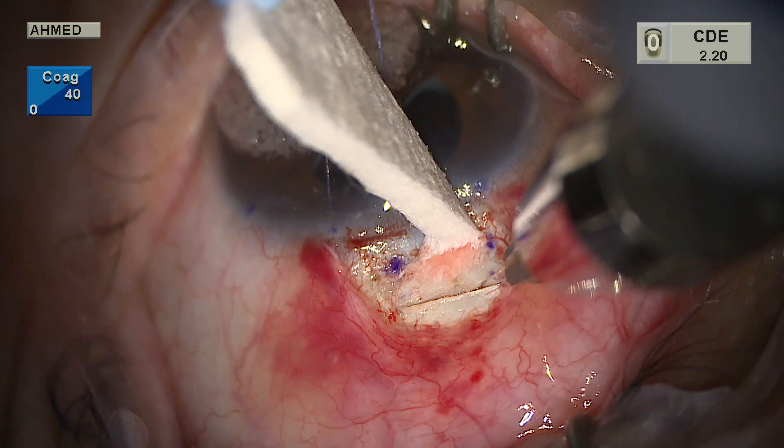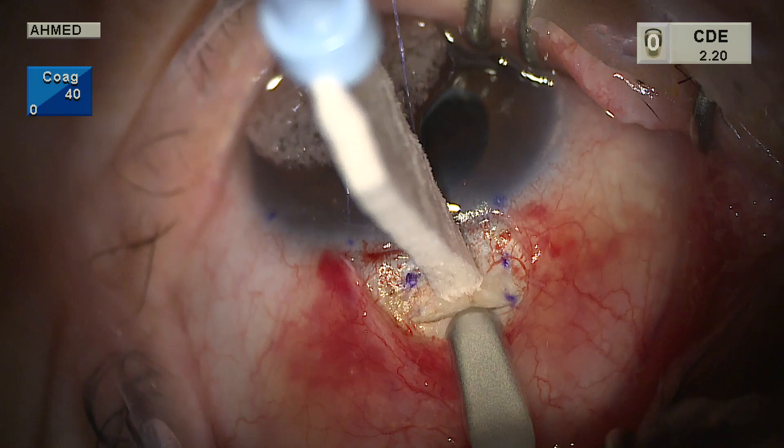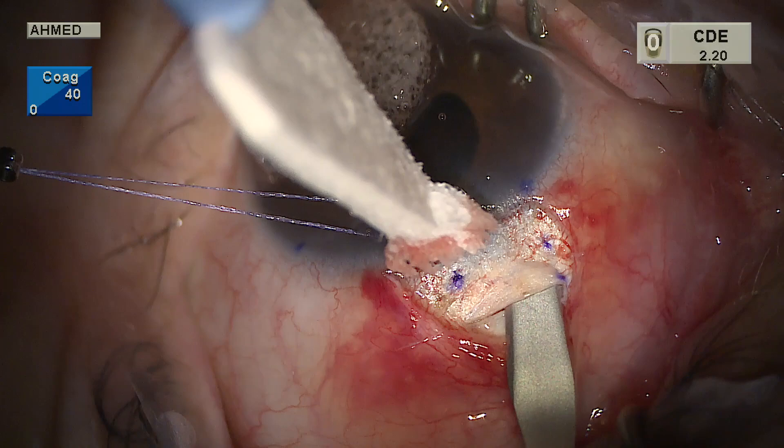A diamond trifacet blade is used to make the dissection, followed by a crescent blade, which can be metallic or diamond. The scleral flap should be half thickness to provide enough resistance. The limbal dissection is started with a wiggly motion to enter the dissection plane, using a tunneling technique. This can also be done with direct visualization by lifting the flap, but the tunneling technique creates a nice smooth bed.